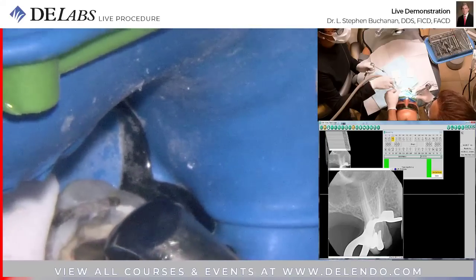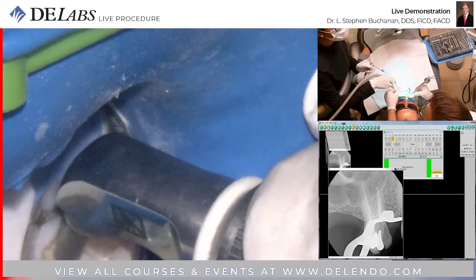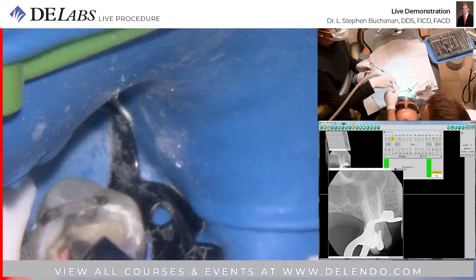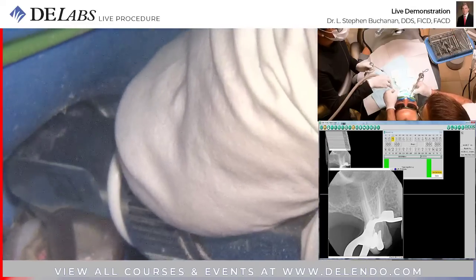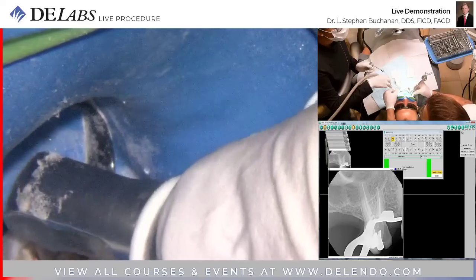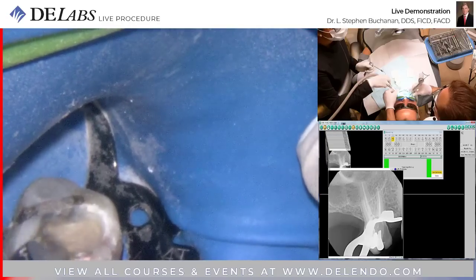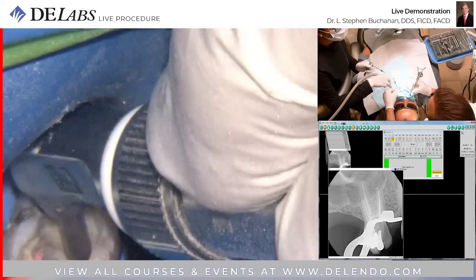This is just awesome. And if you're doing endo through a ceramic crown, it's really nice to have the etching. I learned this from John Coyce. No, it doesn't, because the gutta percha is soft and rubbery.